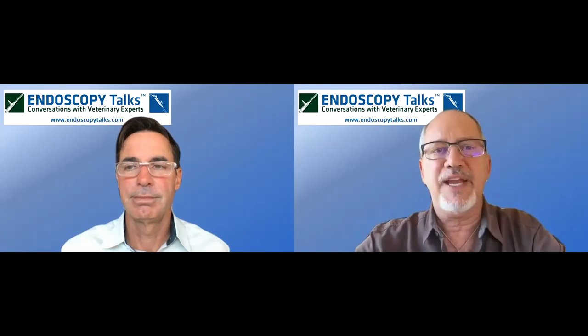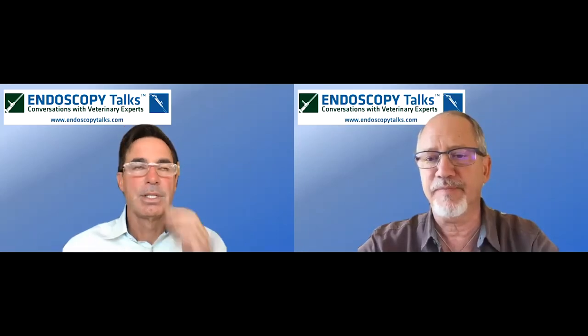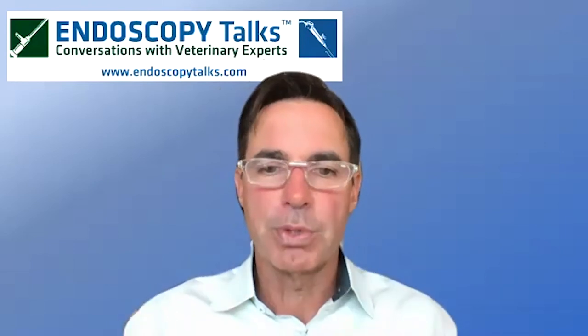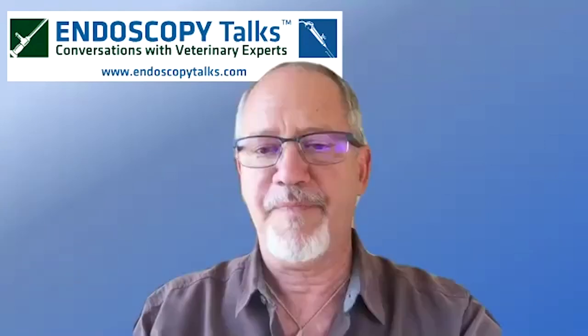Okay, can you speak in general to the post-op management of arthroscopy patients? So in general, post-operative management is pretty simple. We're just going to talk in general terms. We're really not talking about the surgical procedure, say the TPLO or whatever. But if you just scope the joint, generally these dogs, sometimes I'll scope 4 joints at the same time, and these dogs will go running out of the clinic the same day.